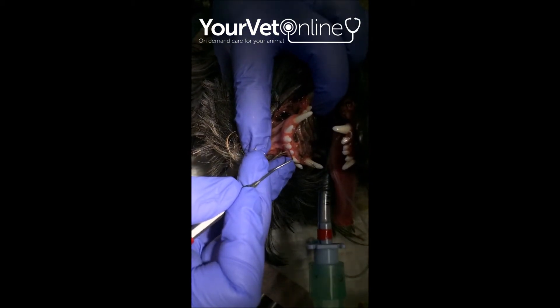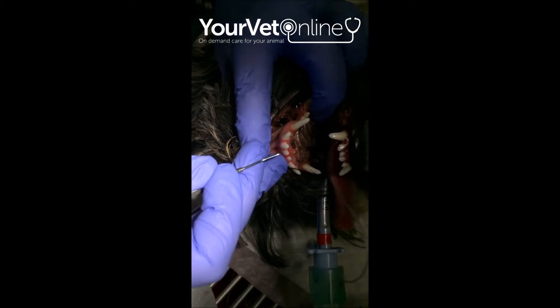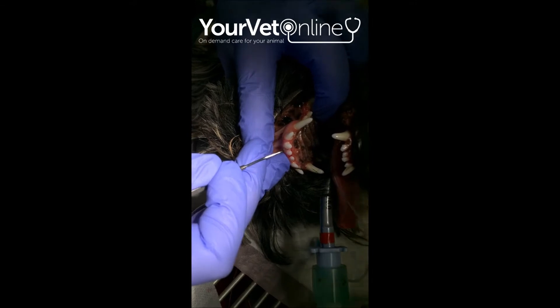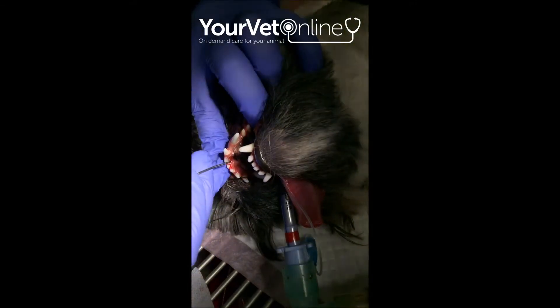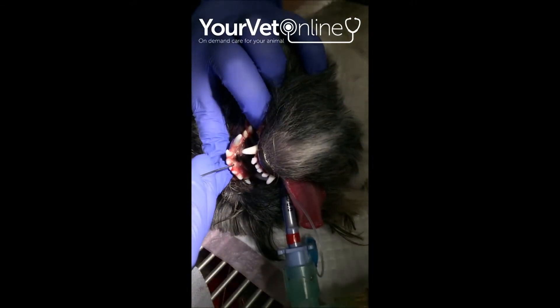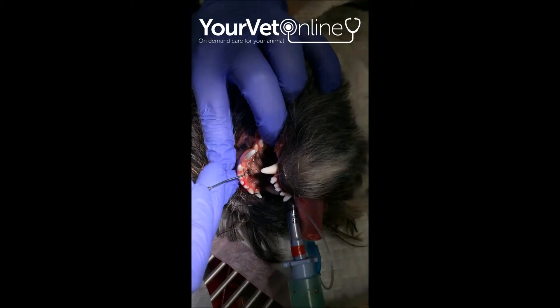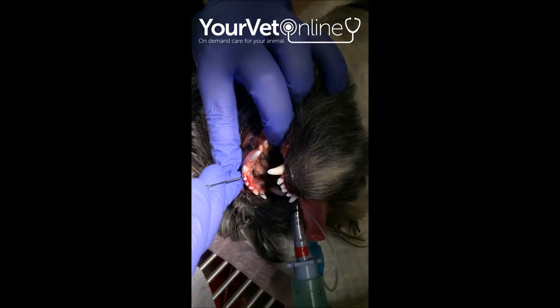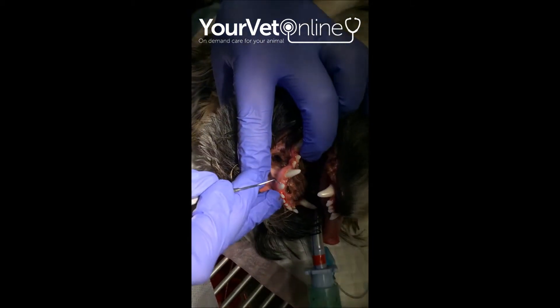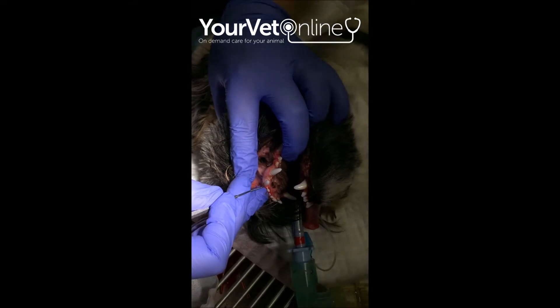During this exam we are also looking at the shape of the teeth and whether there is any food or hair accumulating between the teeth. We look at the whole area and we check for developmental defects such as a cleft palate.